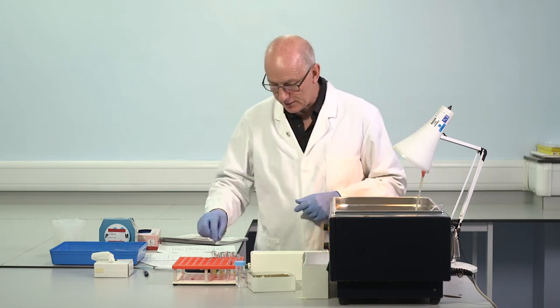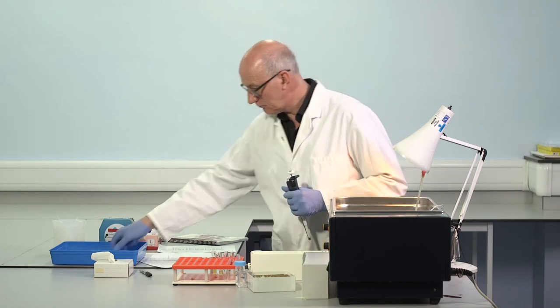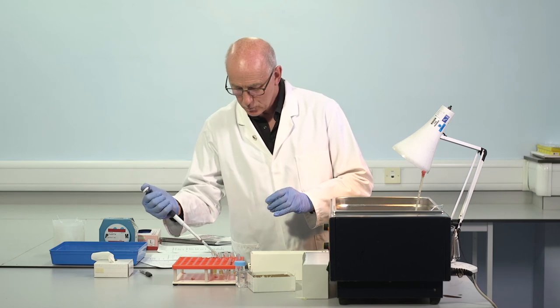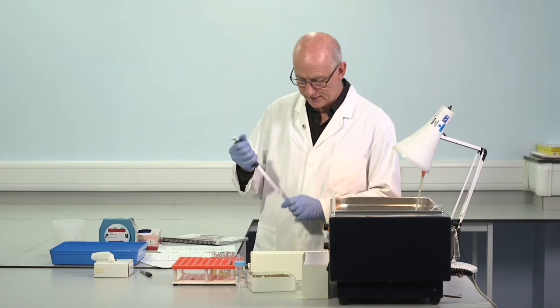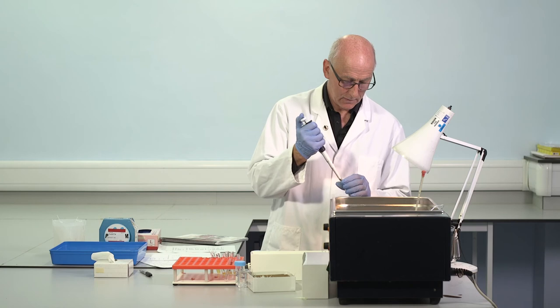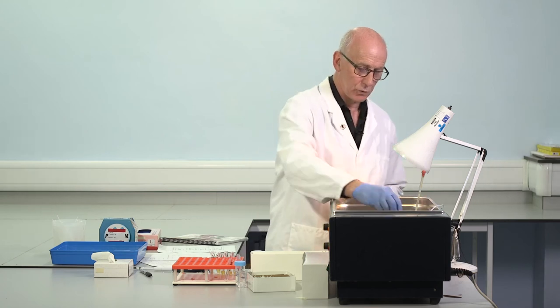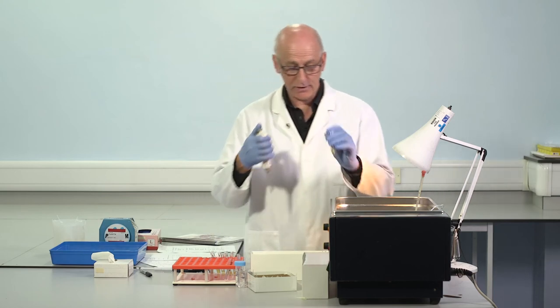Okay, last mix. Pooled normal plasma. Microliters. Patient sample. Number 4. Two tubes. Immediate mix.